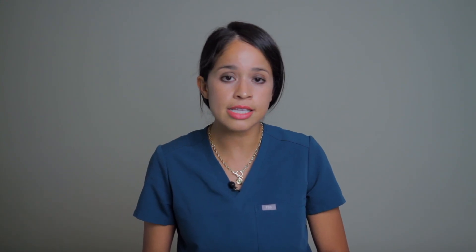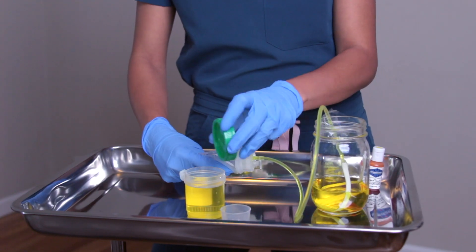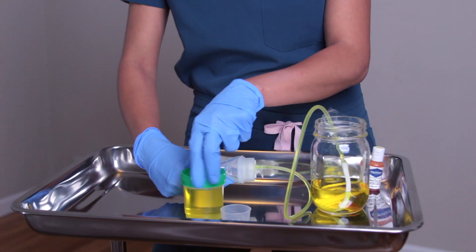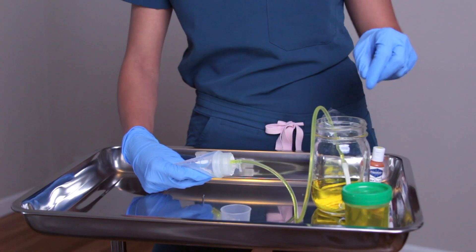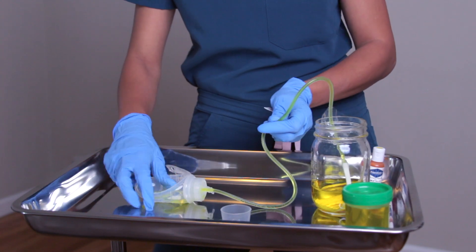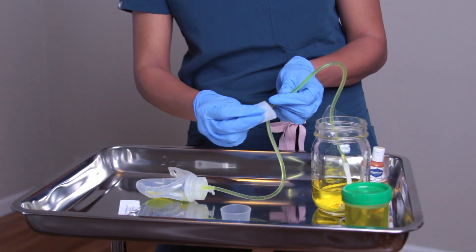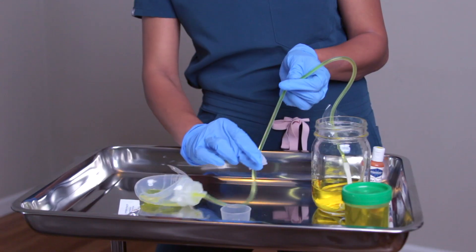Drainage that is actually increasing in amount — you definitely want to notify the physician right away, because that tells me there's increased output and it could potentially be a dehiscence. In the setting of blood clots, you also want to feel comfortable with stripping your JP drain. When you strip it, it's because you want to prevent a blood clot. You hold it at the site of insertion, apply an alcohol prep to the tubing, and strip away from the site. This should not be uncomfortable for the patient — if it is, stop and notify a physician.